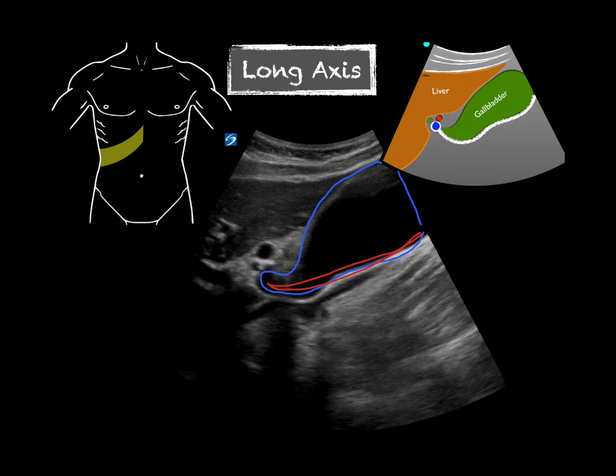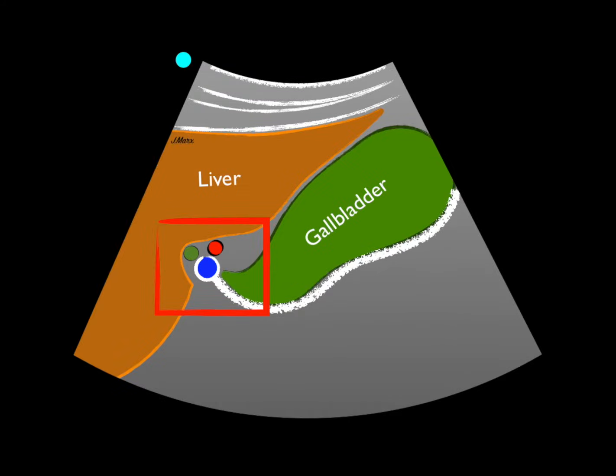And we'll look for shadowing of those. So once we've looked at the gallbladder and evaluated for stones, probably the most important part of this is looking at the gallbladder neck. So if we look here, we want to get down to this portion. And the gallbladder neck will typically be pointed or directed towards the portal triad, or at least it will approximate it. It doesn't always point right at it, but it will approximate it.